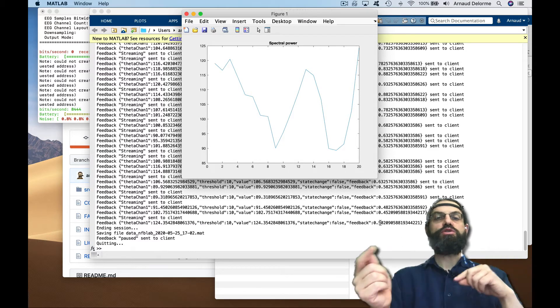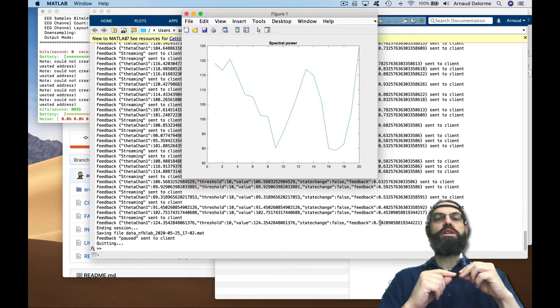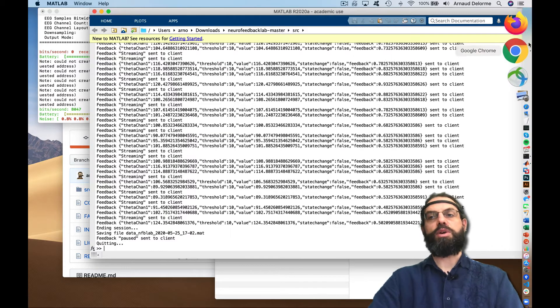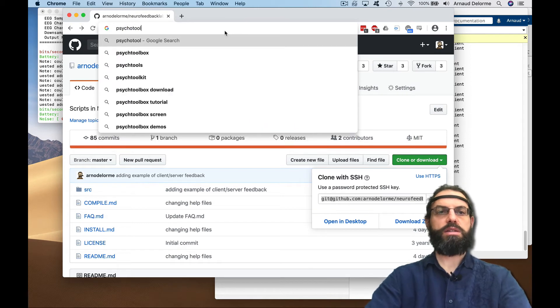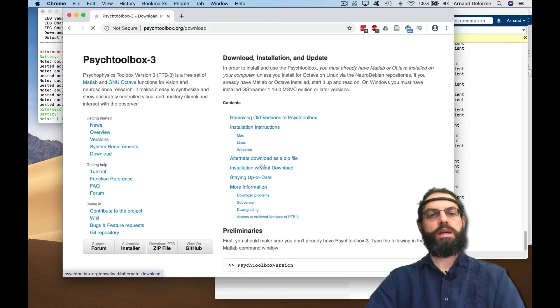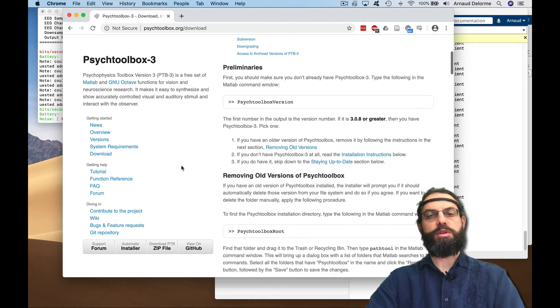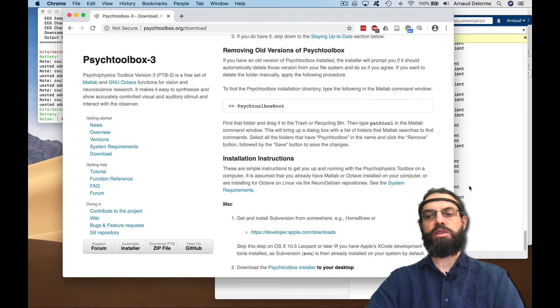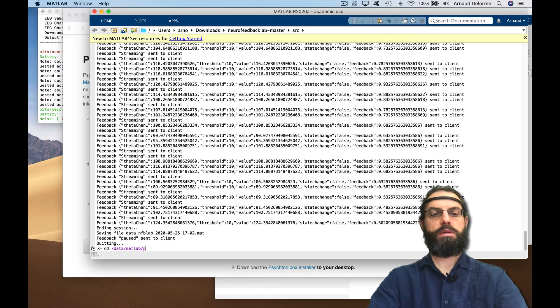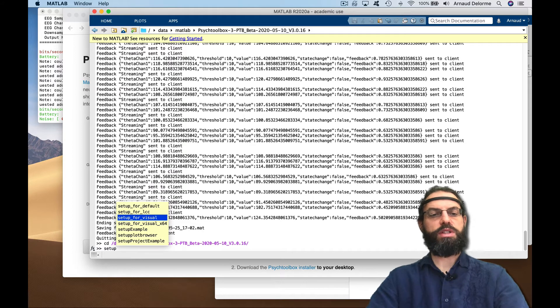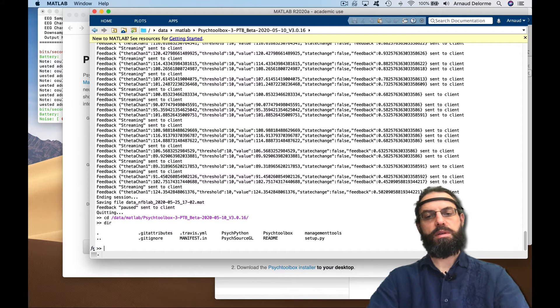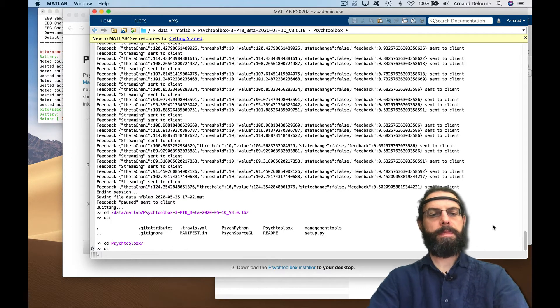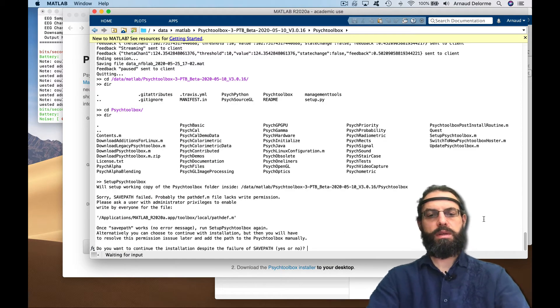Then another way is to control the program using the TCP IP protocol. First, let's look at the psychophysics toolbox. You would download it—I'm not going to download it here because I already have it installed, but basically you can download a zip file here. Now I'm going to go to the folder in which it is downloaded, the psycho toolbox, and just run the setup program so it knows the path where it is.